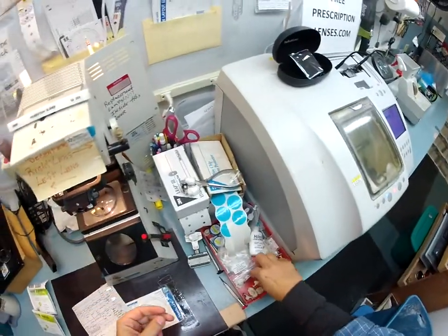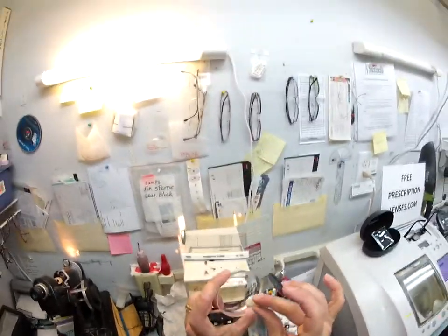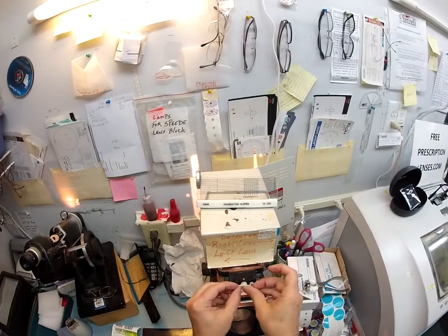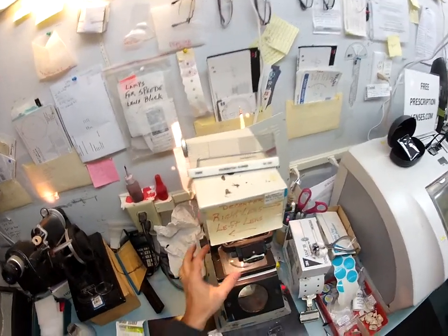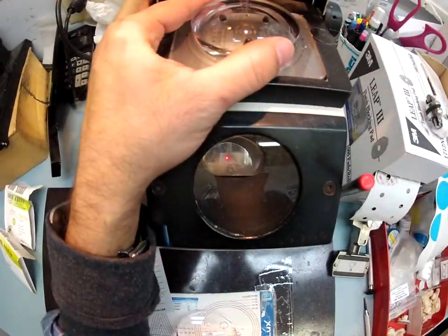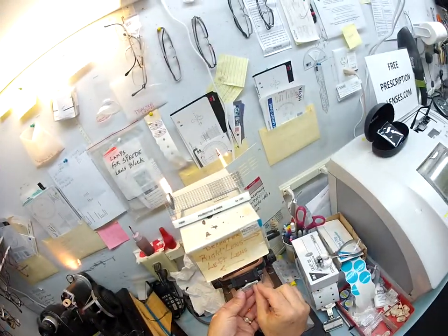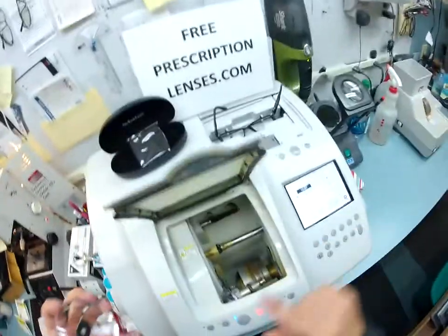I'm going to put a little double-sided adhesive sticker on here. This is what holds it in place while it is cutting. I've got to stick this to the lens — this black side is the sticky side. I'm going to put one side on that, pull off the other side. Line this up in my crosshairs and my scope. That's good. Let's do the left lens — pop that on there. Now let's cut the right.